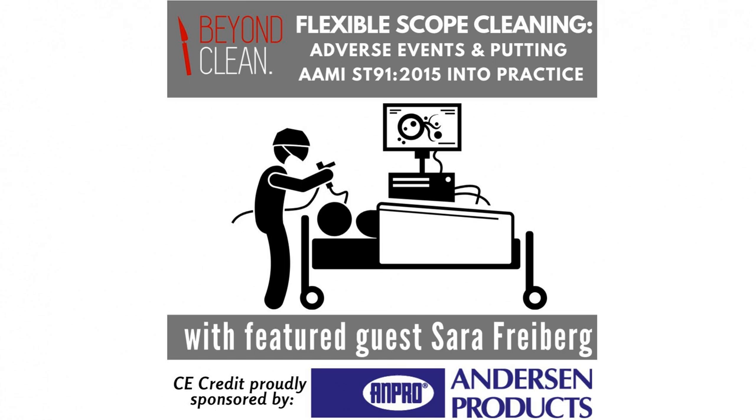There is specific language in AAMI ST91 where it states tools such as video borescopes of an appropriate dimension, length, and diameter may be used to visually inspect the internal channels. A borescope would allow users to inspect the internal portion for any visual debris or damage, and depending upon the facility's infection prevention protocol, protein testing may also be incorporated.